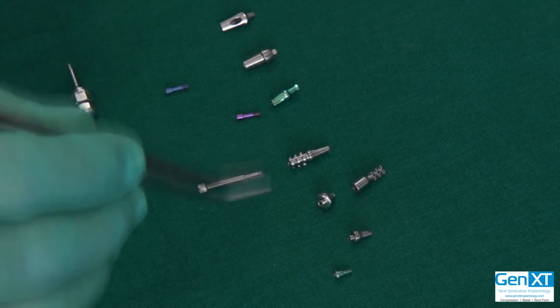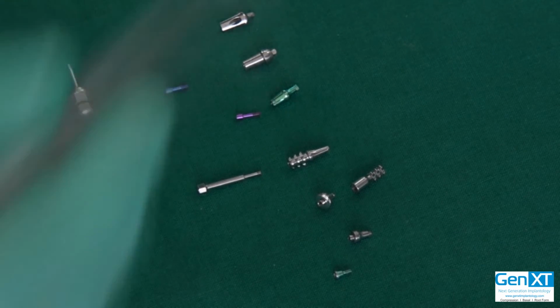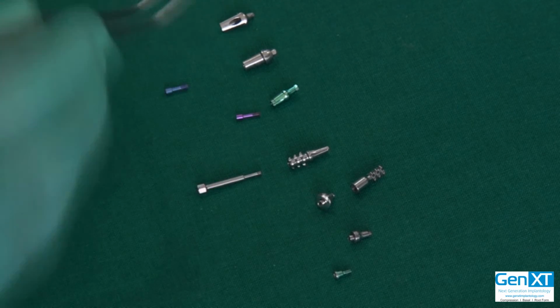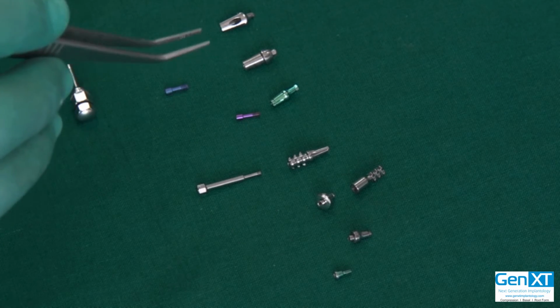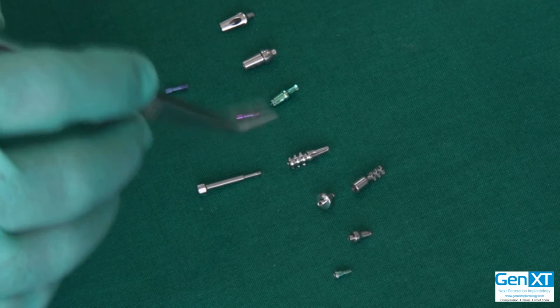These are metal gingiva formers. You also get them in plastic, so they're easier to shape. Once you wait 15 days, or 1 month, or 1 week, however long you want, for the gingiva to mature, depending on whether you've done grafting or not, you have options for taking an impression.